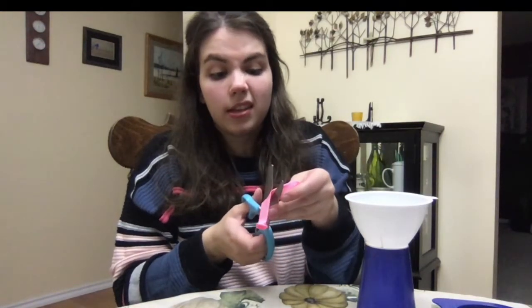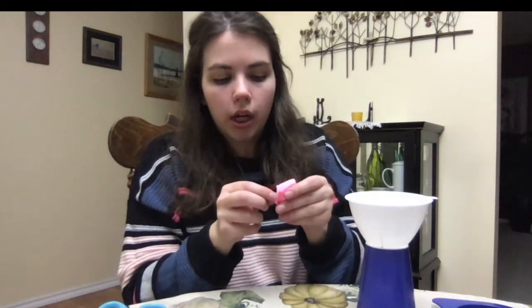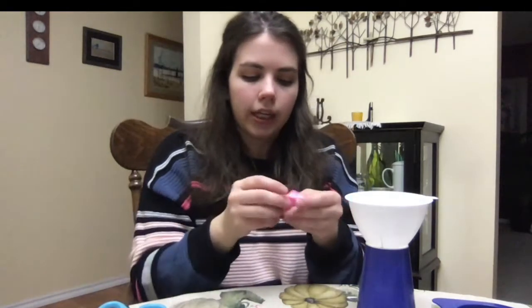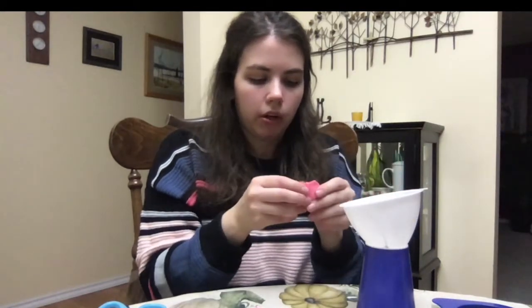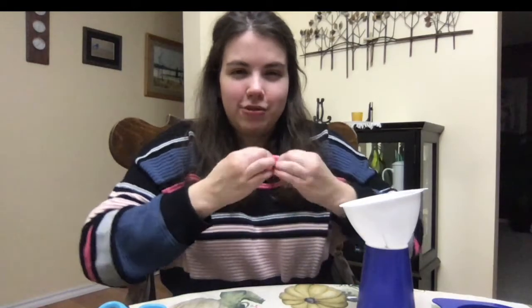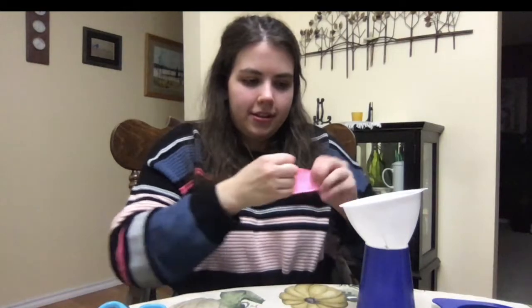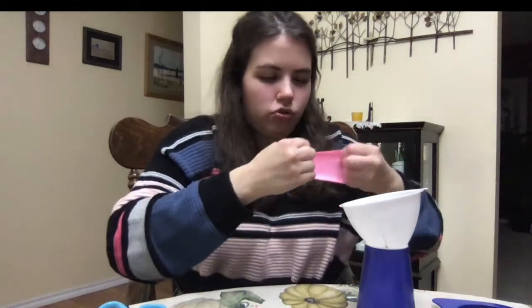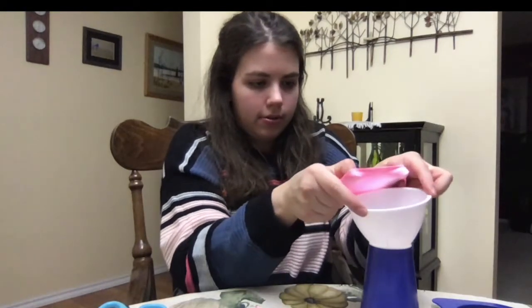It depends on the size of your balloon and the size of your funnel, but basically you want to cut the tight end off and cut it at a point where you think it's going to be able to stretch over this part of your funnel. So it's probably going to take a few tries because usually balloons need to stretch out anyways. And then we're going to muscle it onto here.